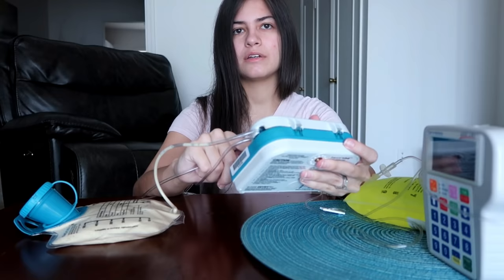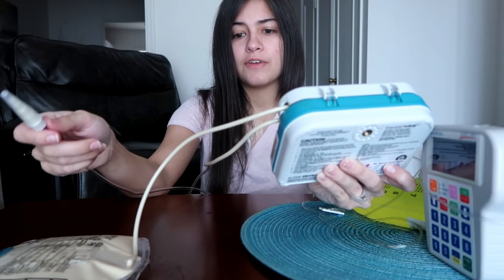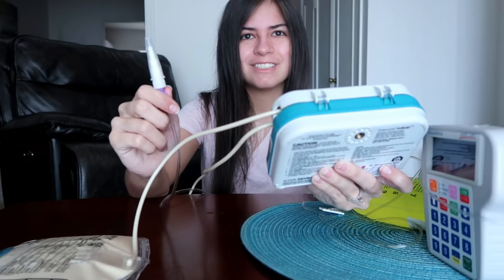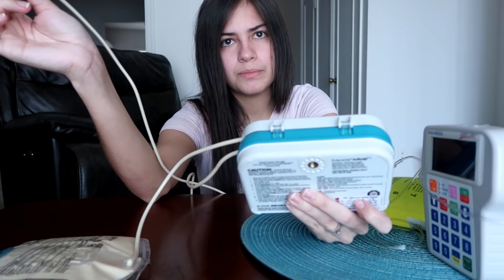And there's a key on here that says prime, and I just hold it down. And you'll see it just sucks the formula through. I prefer to hand prime when I'm able just because it's faster, but when my hand joints are hurting, I prefer to use the pump because it's less painful. And keep your eye on the cap, it'll shoot off like a rocket. There it goes. Almost done. There we go. Then I turn off the pump.